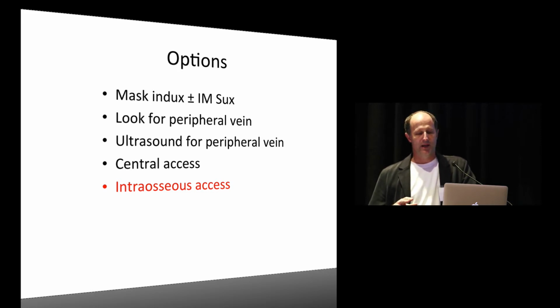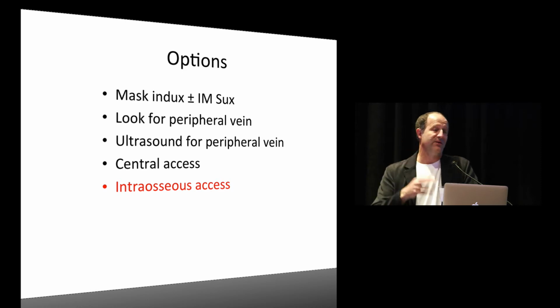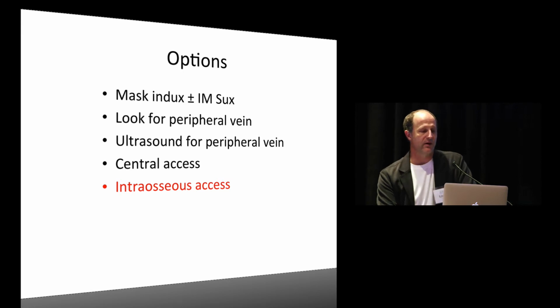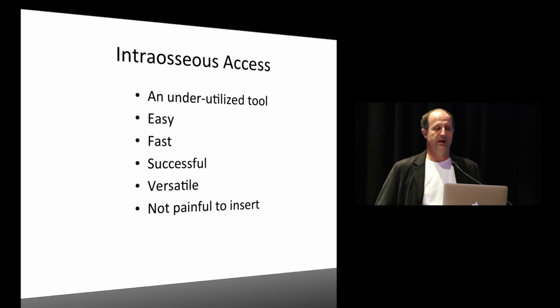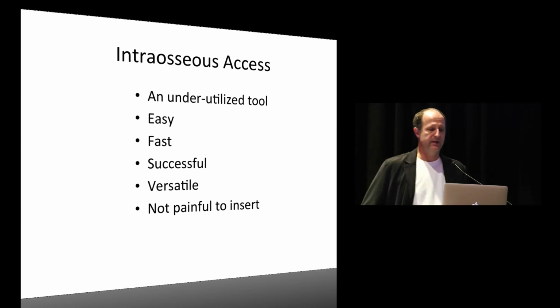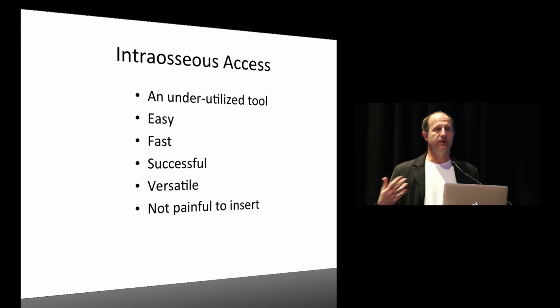effective. And it's interesting, that's the younger guys. The older guys say, well, I always get the IV, or I always find some other way. They don't use it. But I think it is a great tool. I think it's really underutilized. It's really easy, really fast, highly successful, versatile, and it's really not that painful to insert in an awake patient. I mean, when you think about where you're inserting it, into the bone, you think, God, that's got to hurt when they drill that into the bone or dig it into the bone. But it's not that bad.